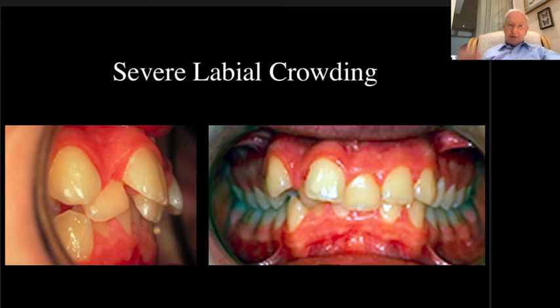This patient was treated by Dr. Gordon Klusak, who was the first doctor on the American continent to learn about twin blocks and arch development techniques when he came to a course in Scotland in 1990. He went back to his pedodontic practice in Canada to put these techniques into practice, and he was expert in twin blocks and arch development. How would you treat this patient?